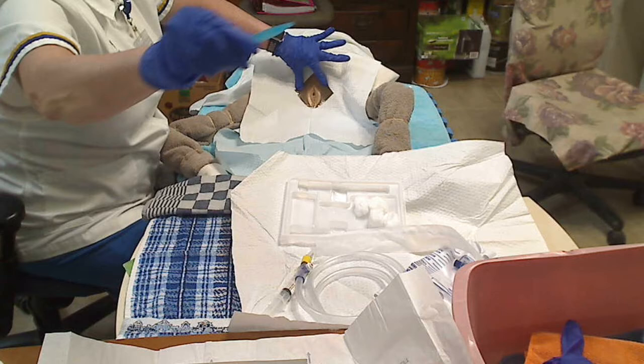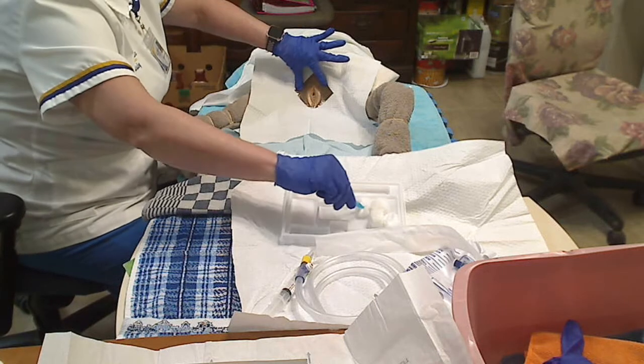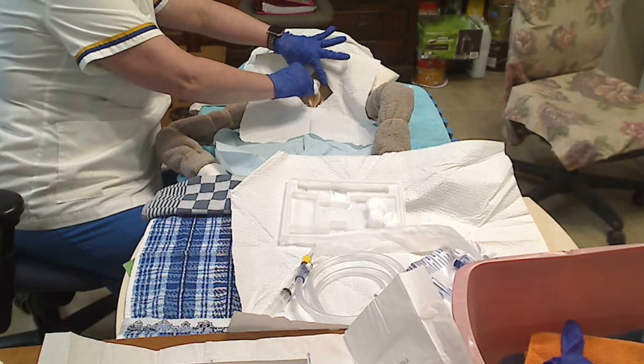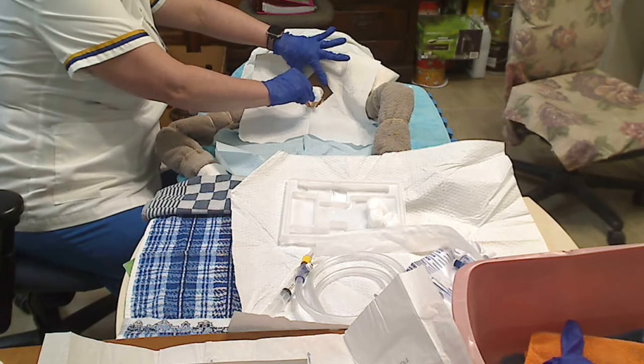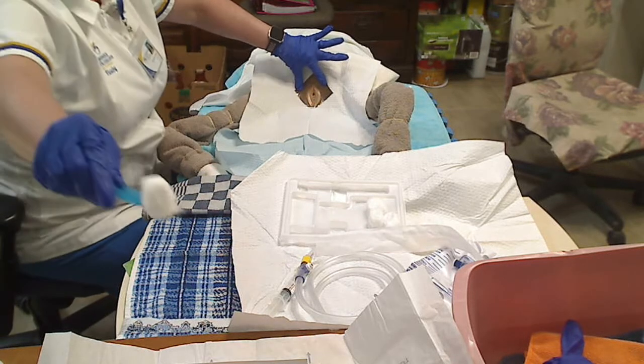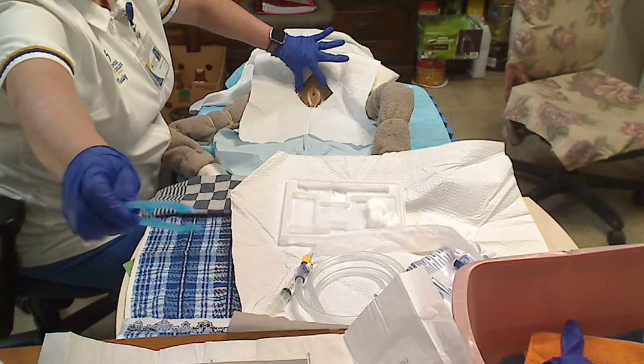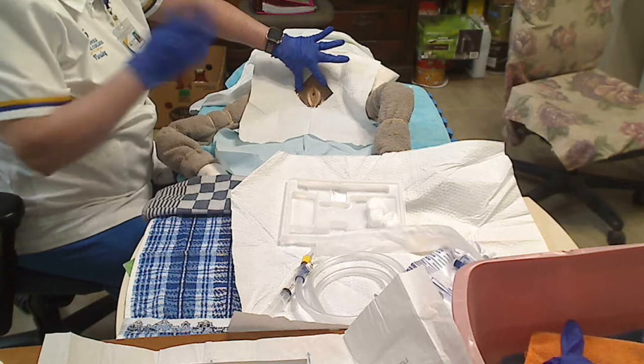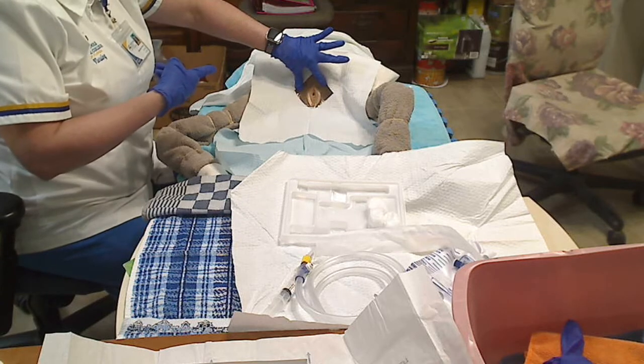Drop it. You doing okay, Miss Anna? Yes. I will do one straight down the center for the urinary meatus, and again drop it so as not to break sterility. I am also dropping my tongs. From here, my non-dominant hand stays.